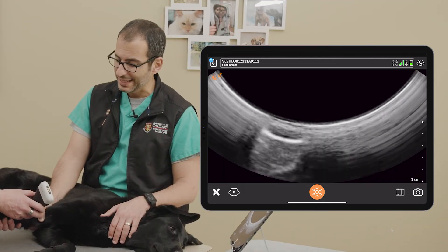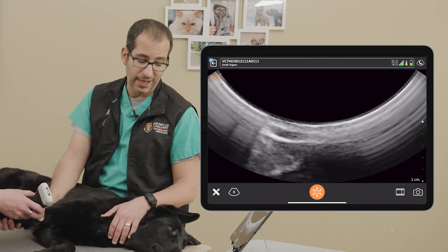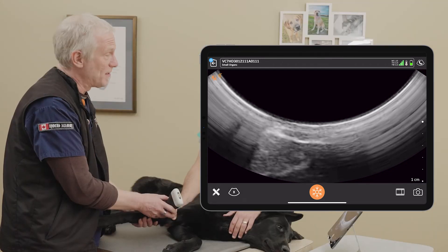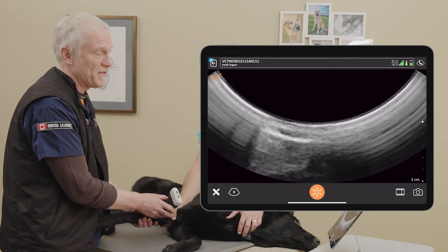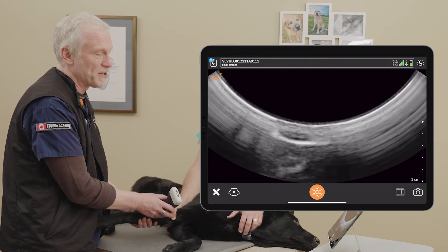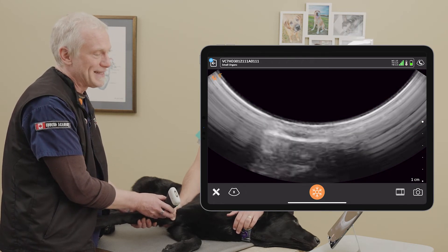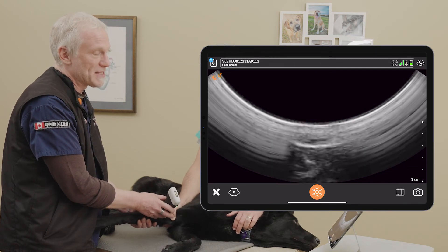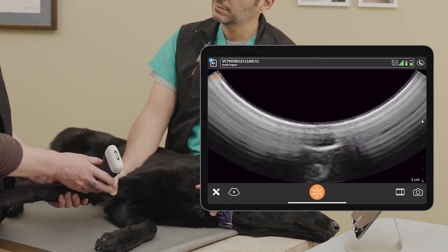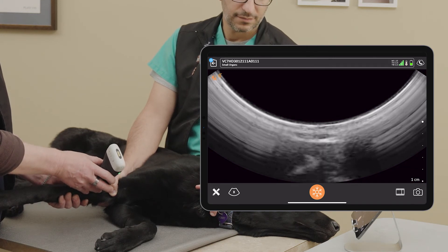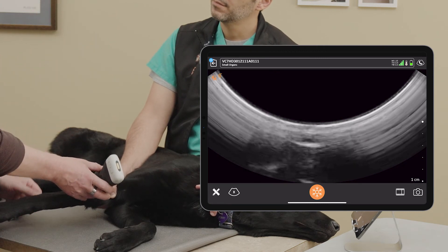We have to remember, Dr. Boysen, the scanning surface area here is quite thin — that's why we see all the artifacts on either side, because that is truly all we have to scan since she's such a thin dog. That vessel is at the peak so I can only get contact right over the vessel; on either side I lose it. But when you've got edema or very thick skin, you can actually get better contact. We're sitting at about 0.25 centimeters depth where the center of this vessel is. We can slide along that, make sure it's patent, check for thrombosis, and when we have edema or thick skin we can use ultrasound guidance to walk a needle through — the more edematous or thicker the skin, the easier it is to find and hit that vessel.